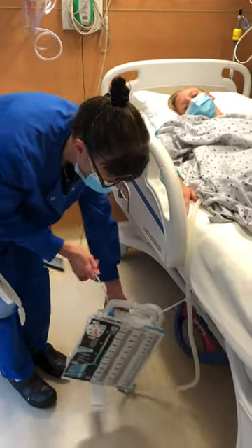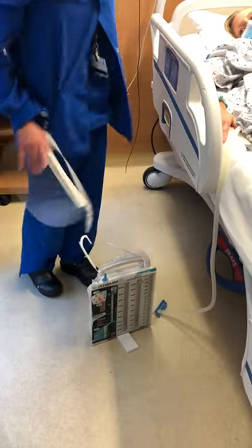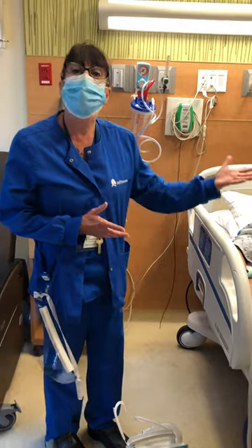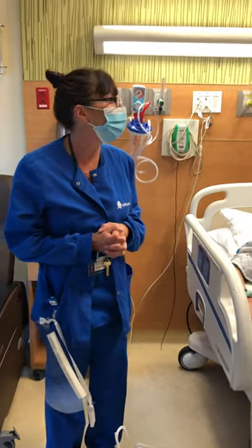One thing to note, if a patient does have a chest tube to wall suction, the patient cannot travel down to chest x-ray and be removed from that wall suction. If the patient has the order for the wall suction, it needs to remain on at all times.